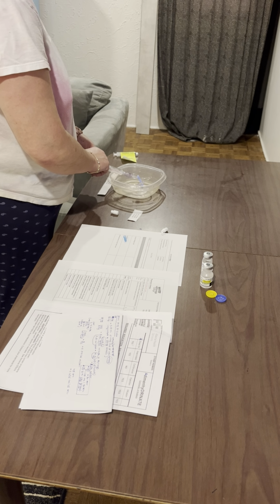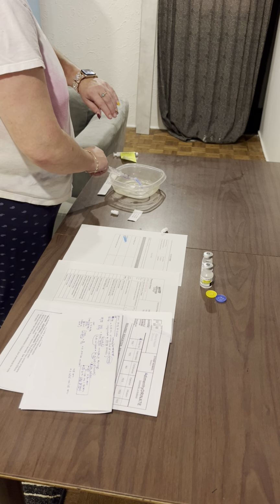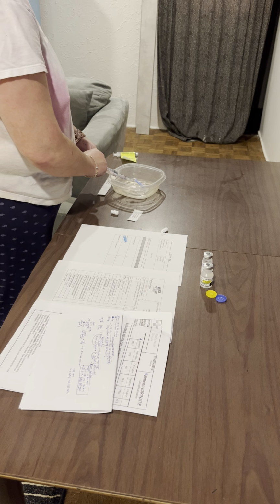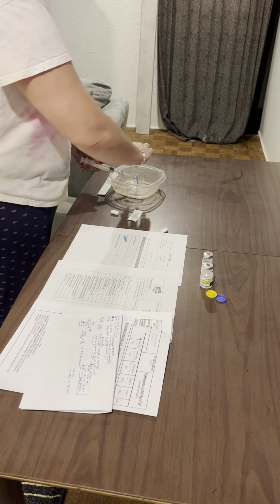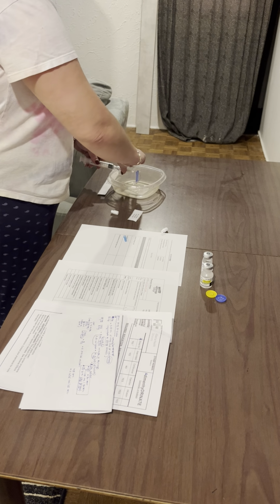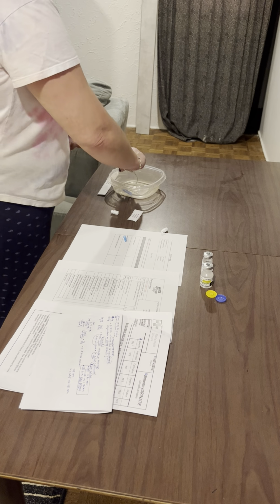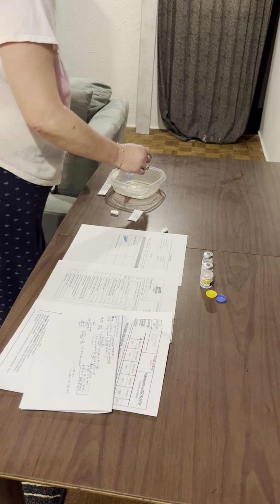And then we'll go up to 7 and wait 30 seconds. And assuming the patient tolerates the procedure well, then we can just push the rest of the medication through.